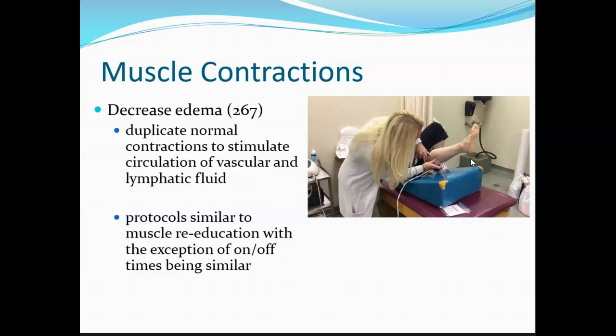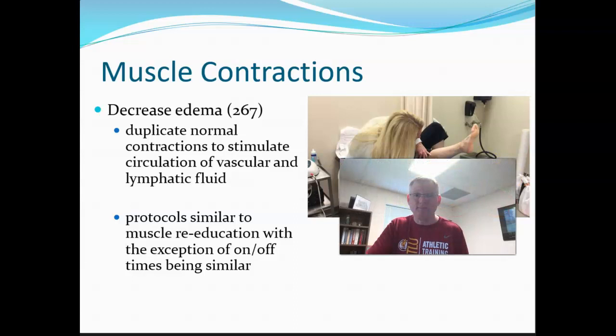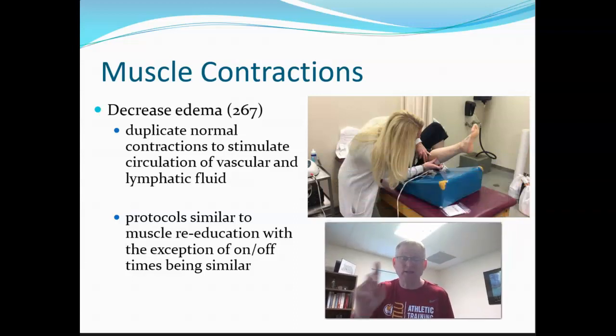Here's the thing I want you to realize, and I'm going to put my face in there now. Look at this. This is how serious this is. When you do this for class, if I give you an ankle and say, hey, we're going to do an E-stim to get rid of edema, and you go, man, I want to contract some muscles. If you put your pads right around the ankle injury site, what are you contracting?